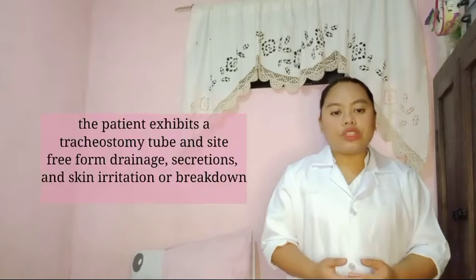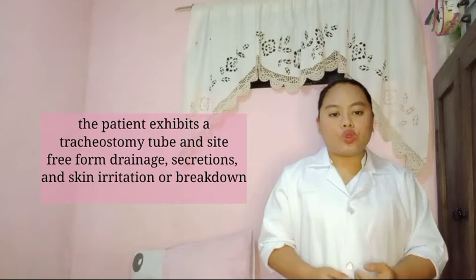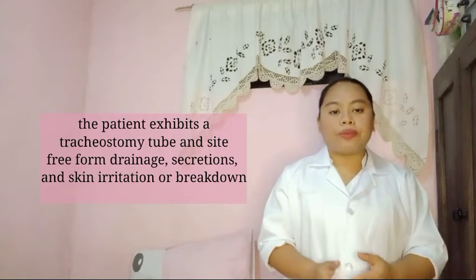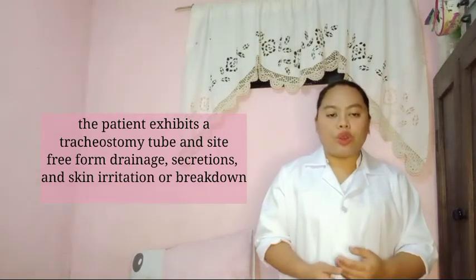The goal of this procedure is that the patient exhibits a tracheostomy tube and site free from drainage, secretions, and skin irritation or breakdown.